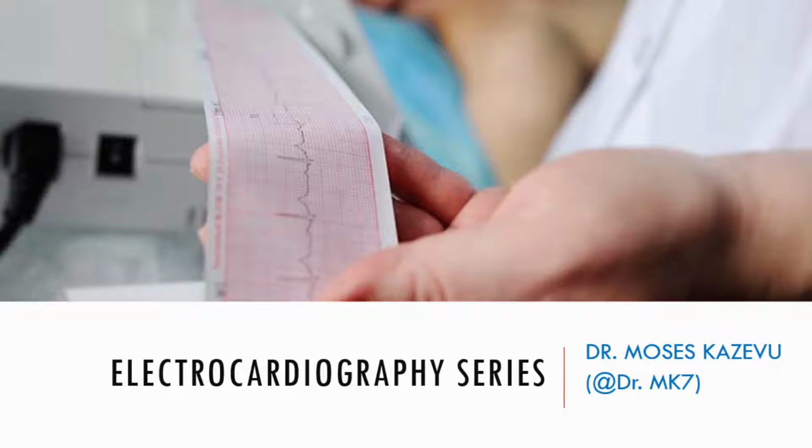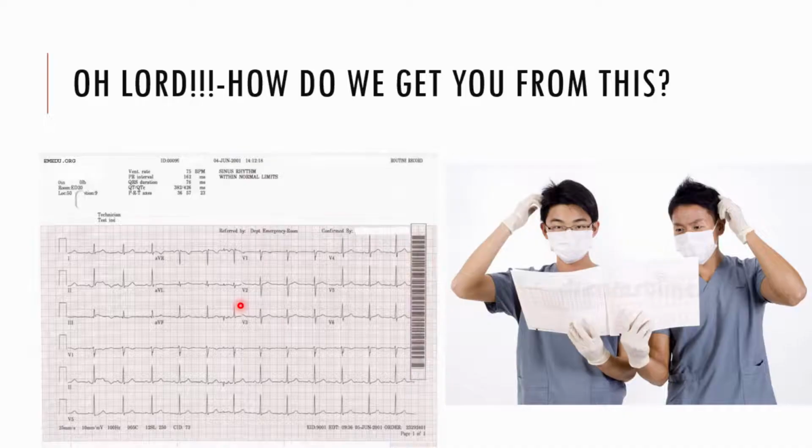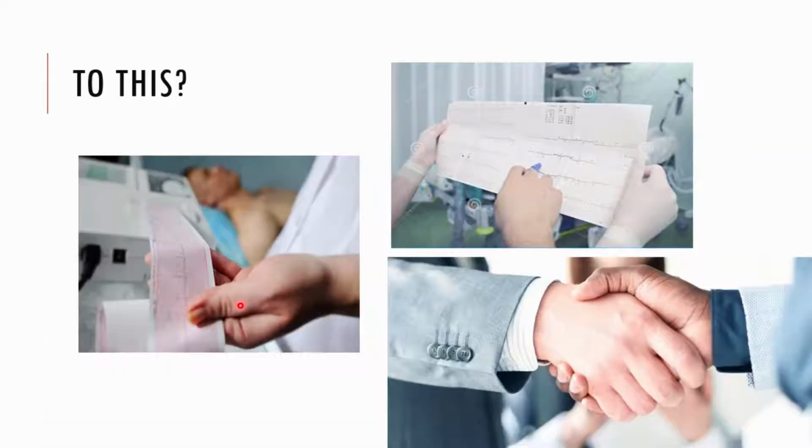Remember, these are a series of lecture videos that are going to be teaching you what you need to know about ECG. So we're getting you from this to understanding exactly what is going on with the ECG and what you need to know as a student, what you need to know as a healthcare practitioner.